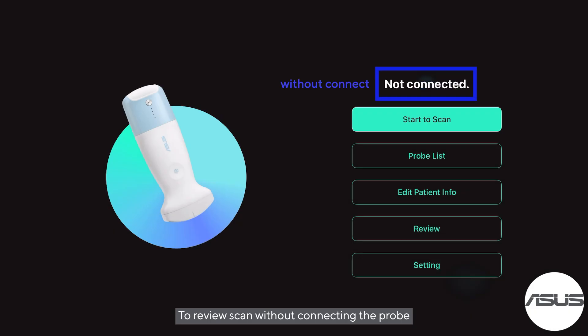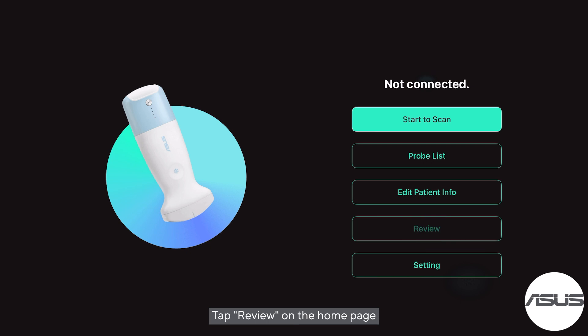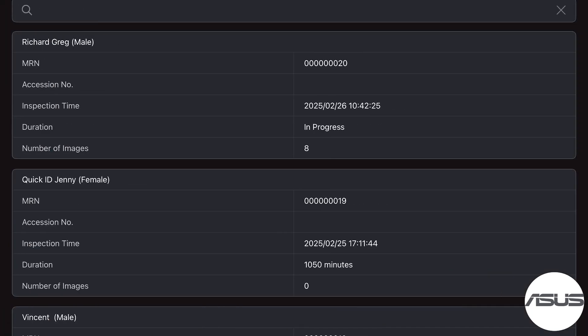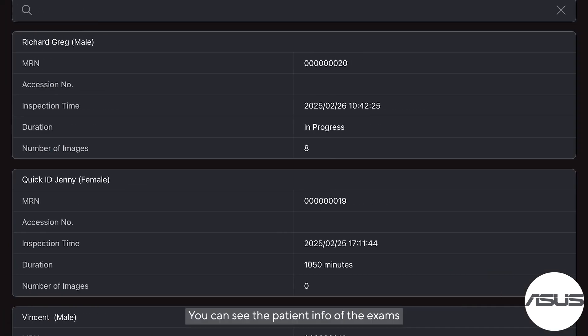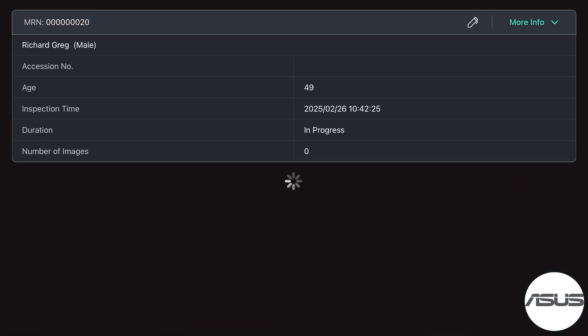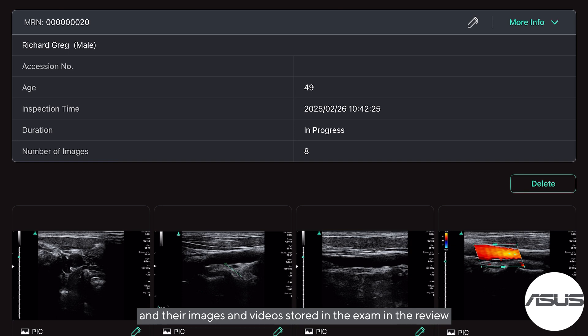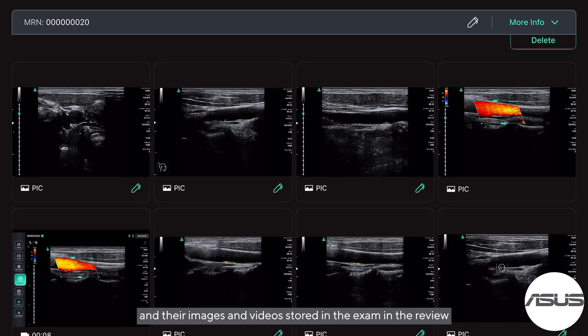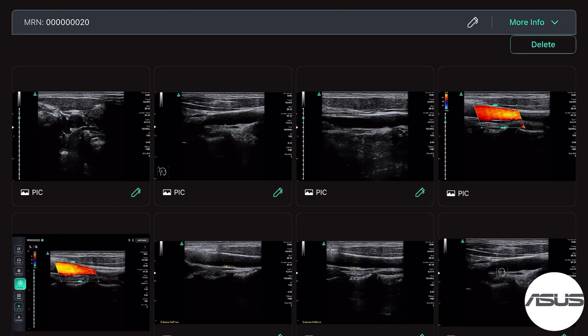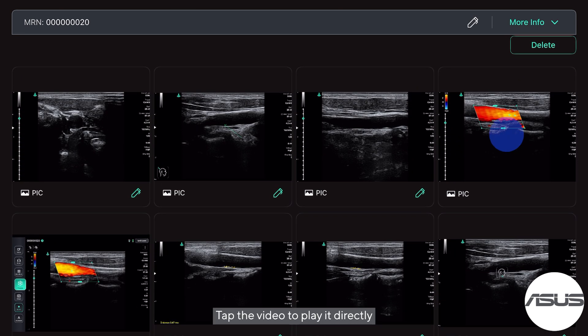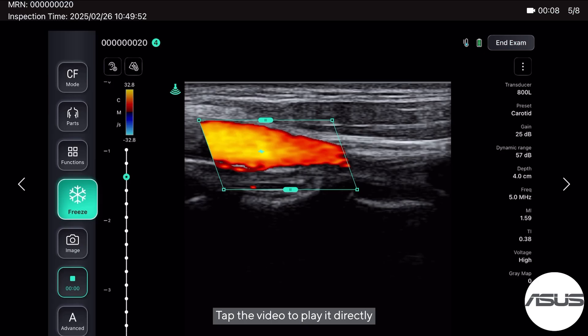To review a scan without connecting the probe, tap Review on the home page. You can see the patient info of the exams and their images and videos stored in the exam in the review section. Tap the video to play it directly.